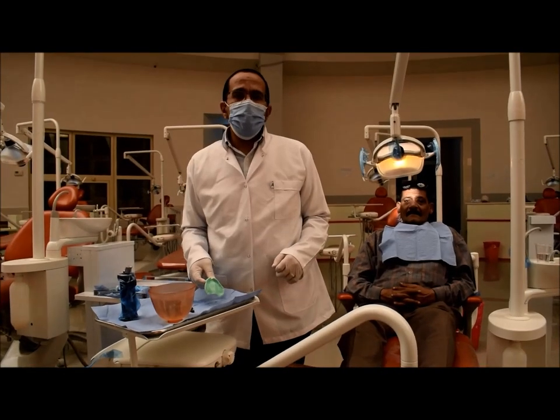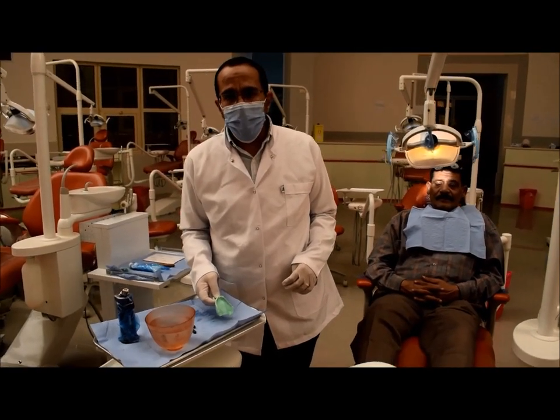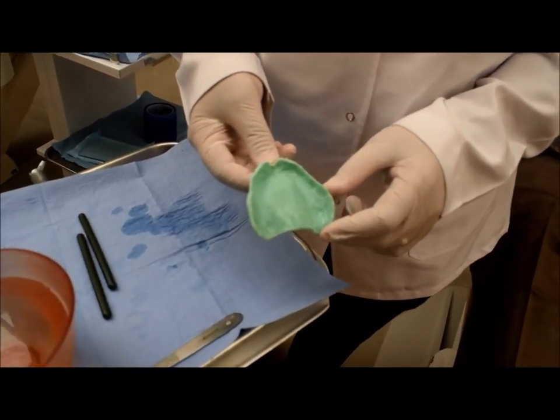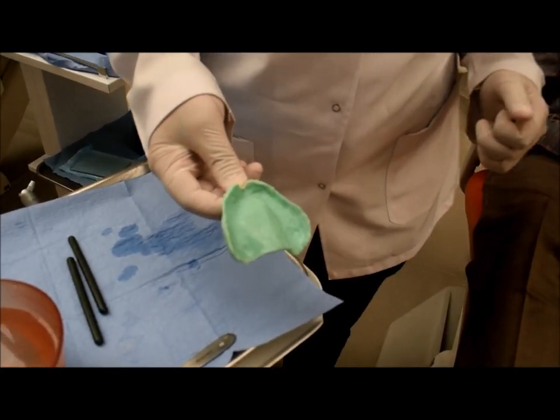Today, we will talk about making secondary impressions for a completely edentulous patient. The special tray is made of acrylic resin. I have to check it inside the patient's mouth before making the impression.